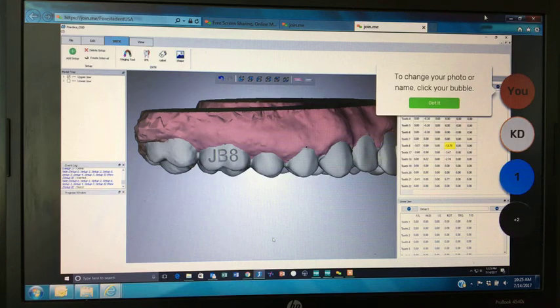Okay, and then there's another question about deciding on attachments for the particular tooth movement. Okay. That really is a matter of preference. We really see everything come through here as far as the ovals, the circles, the squares, the rectangles. I find that certain doctors prefer the round shape or the oval shape, and some are sticklers for the rectangle and square shapes.